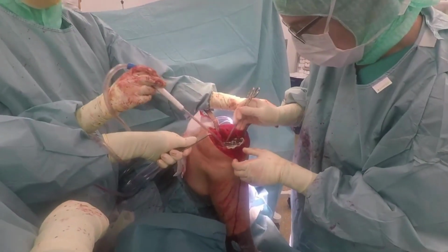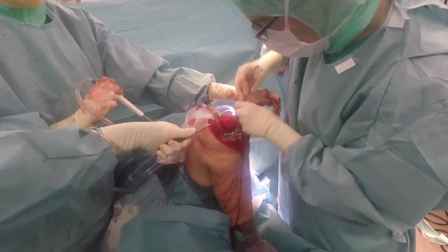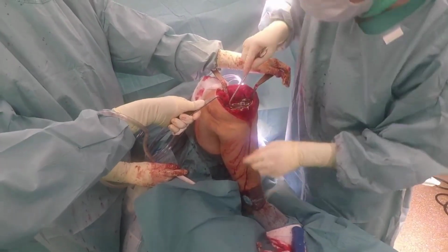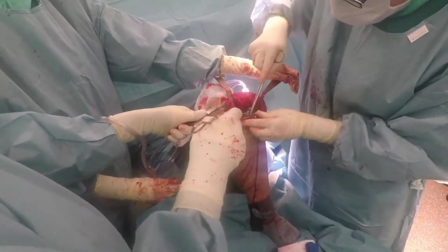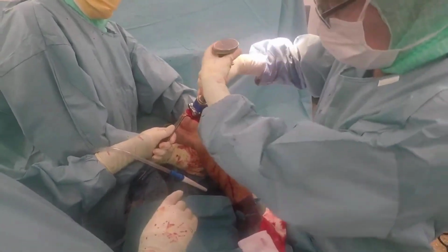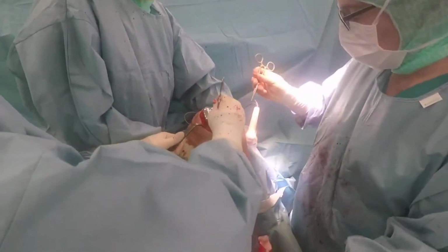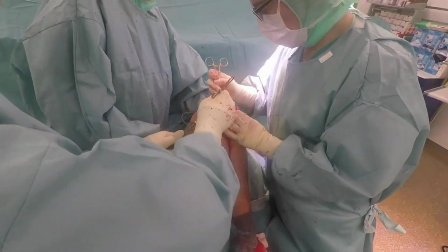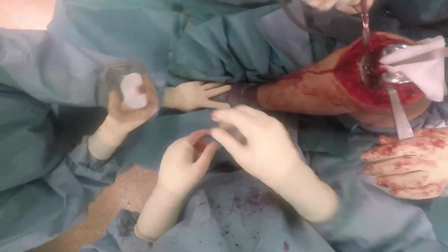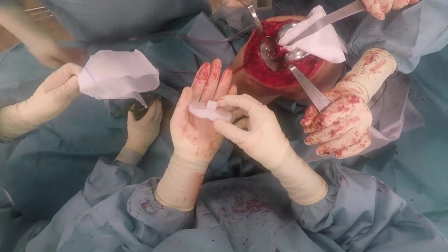The surgeon now places the component on the tibia first, followed by the component on the femur, taking care to remove any excess cement that may come out when each prosthetic component is pressed into place. It takes between 12 and 15 minutes for the orthopedic cement to harden completely. When the cement is completely hard, we insert the plastic component, or rather, the high molecular weight polyethylene component.